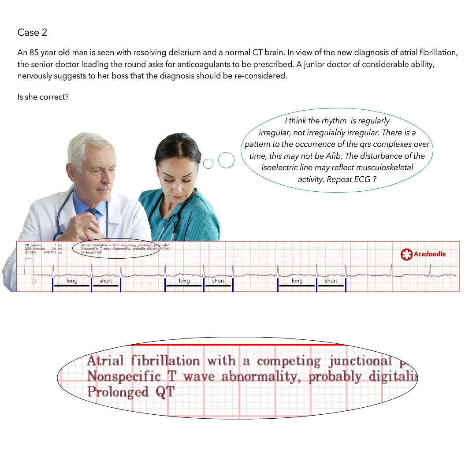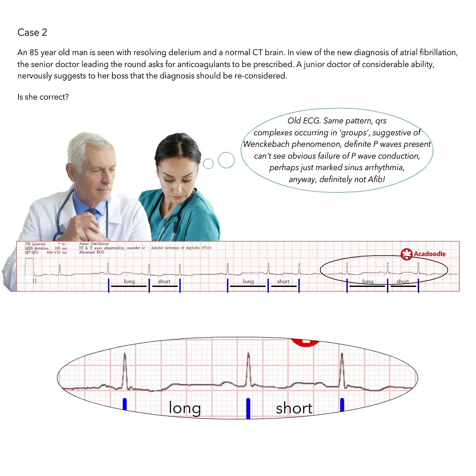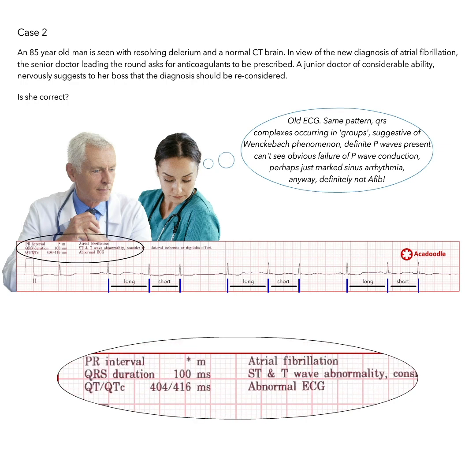In fact, on review, the same regularly irregular occurrence of QRS complexes was present on previous ECGs, with obvious P-waves present. Note that even in the presence of obvious P-waves, the computer interpretation is still incorrectly calling this rhythm atrial fibrillation.